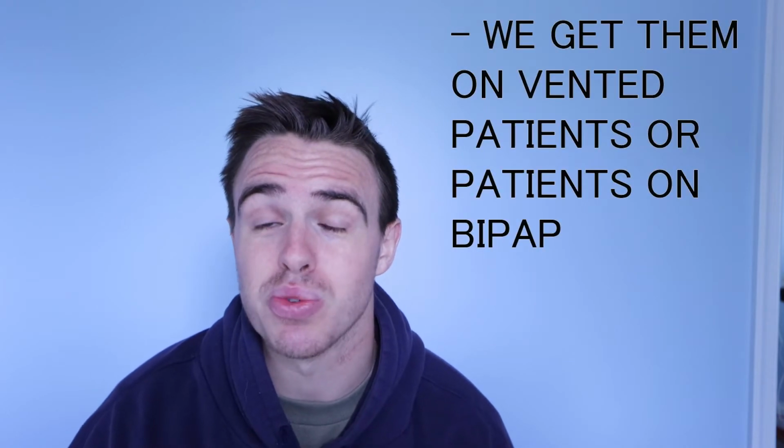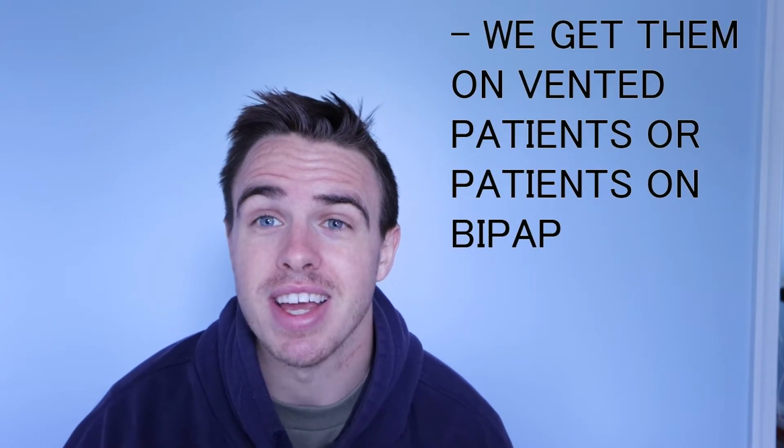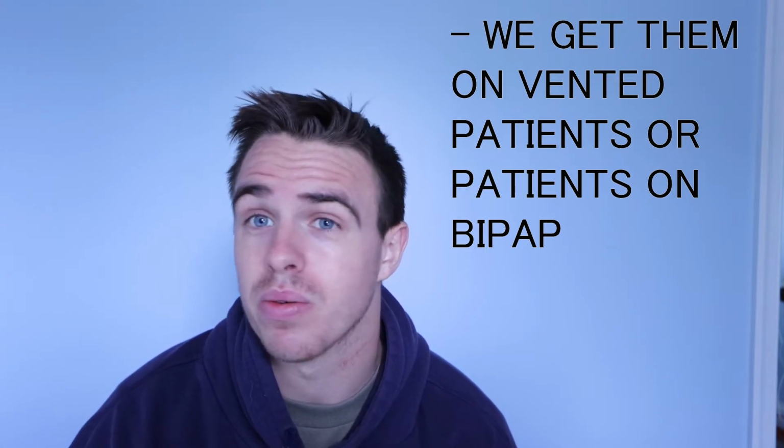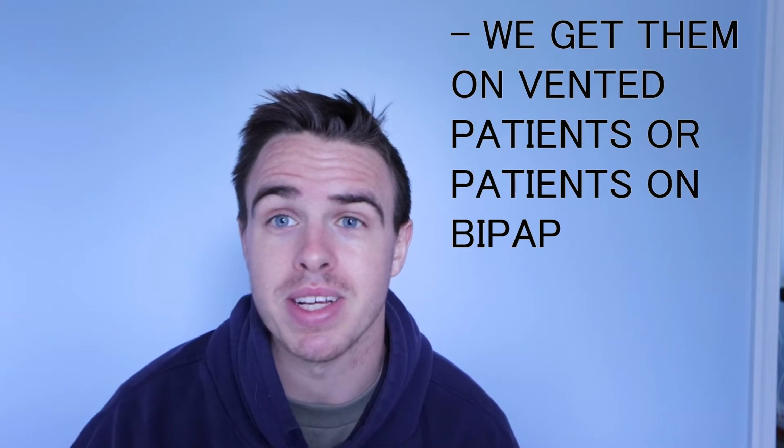There's so many different reasons why we would need an ABG, and a lot of times you're going to notice in the ED, a lot of physicians will go, okay, we need an ABG, we need a CBC, we need to know all this stuff. So we can do it down in the ED as well as the ICU and on the floors.